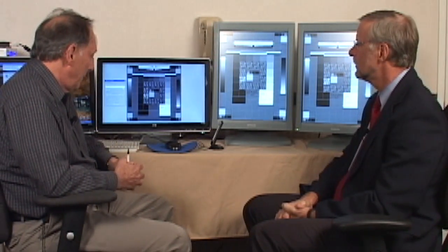But when you get into the ultrasound or the sliced images like MR or CT, where you're only working with an image that starts out at 256 square pixels, you're not working with a very high spatial content image to start with. Now they do have a phenomenal dynamic range, which does inhibit their appropriateness to commercial displays. Sure. However, you can put numerous sliced images up here, and through the digital tools of window leveling, you can extract the information out and have a presentation even with the 8 bits and just basically concentrate on an area of interest within the image itself for the dynamic range. Sure. So you can do just about everything on these.